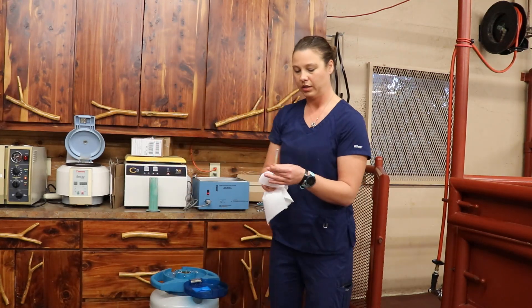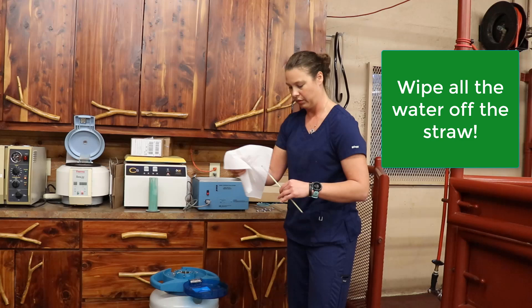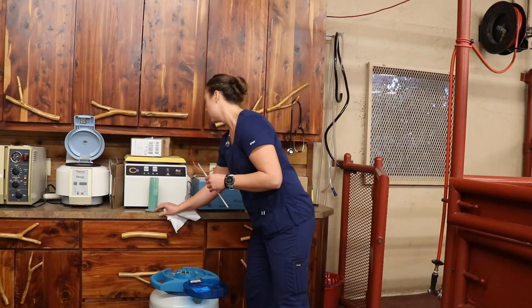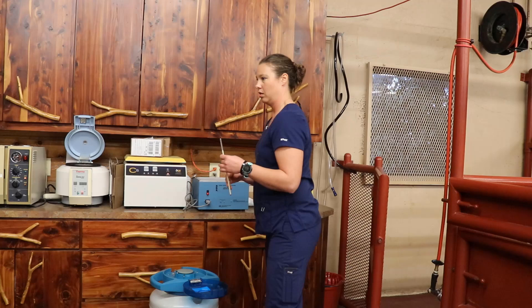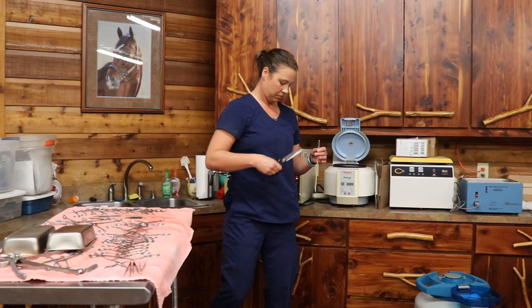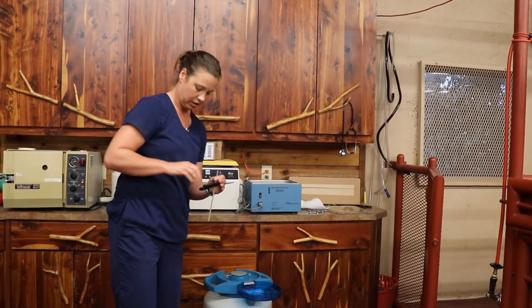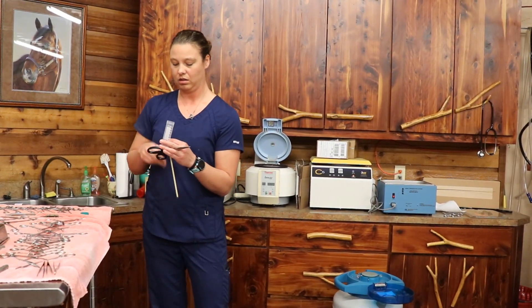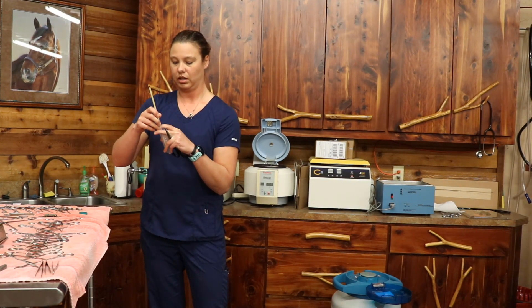You want to wipe all of the water off the straw because water is sperm toxic, and we don't want any of that accidentally dripping in. We then hand off the straw so we can transfer it into a sterile container.